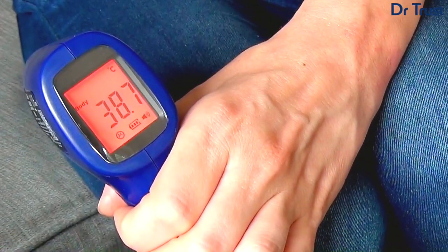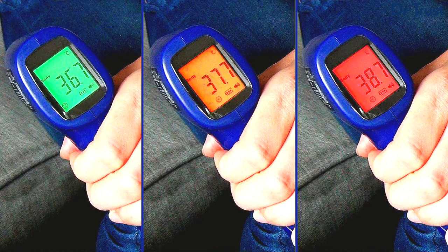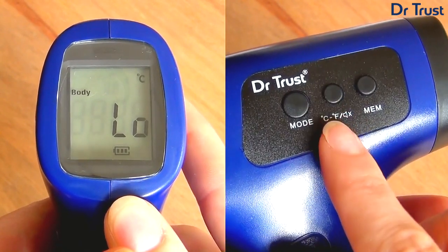In orange and red modes, you will hear a series of beeps and see the screen flicker as a warning that you may have a slight or high fever. If you prefer the device to remain silent, you can put the device on mute by pressing the mute button on the side.